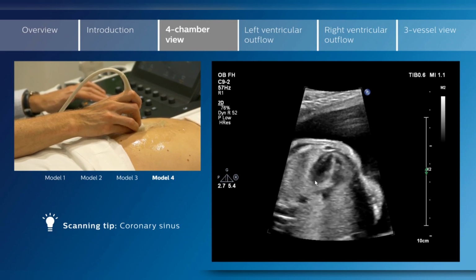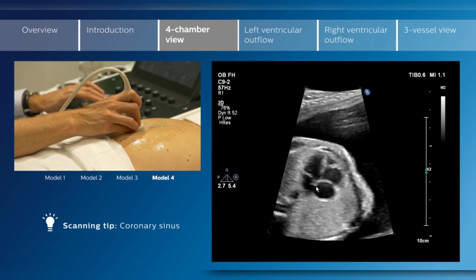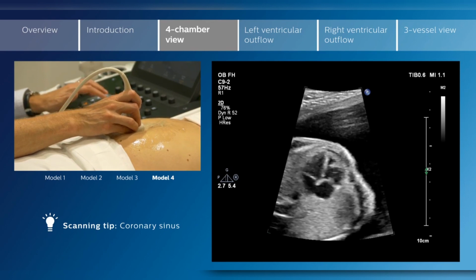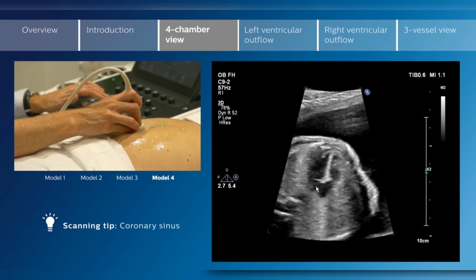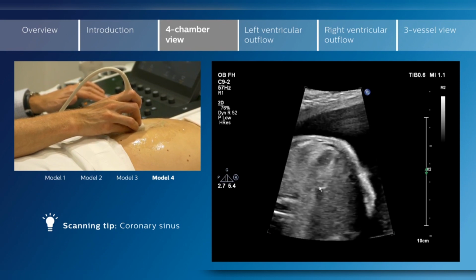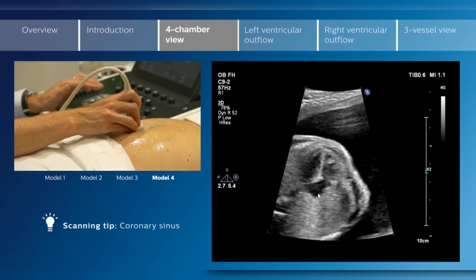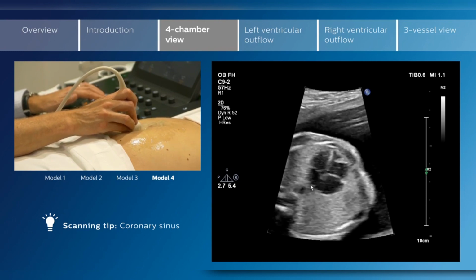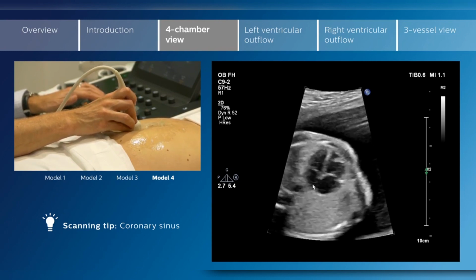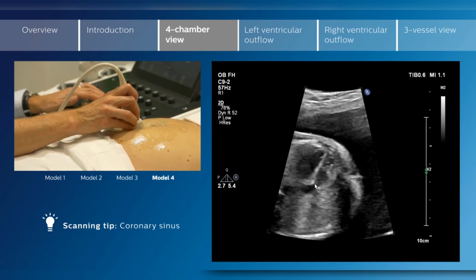And if it's just that, as you pull up, you now see the primum septum normally to confirm that there is a normal primum septum there. And as you angle inferiorly, you see that again, this line of the coronary sinus. This is a normal finding, but it's important to recognize as something which may, if you're scanning slightly off axis, cause diagnostic confusion.